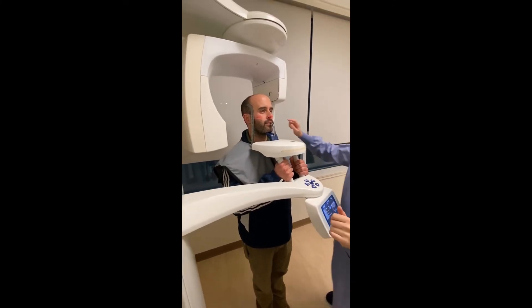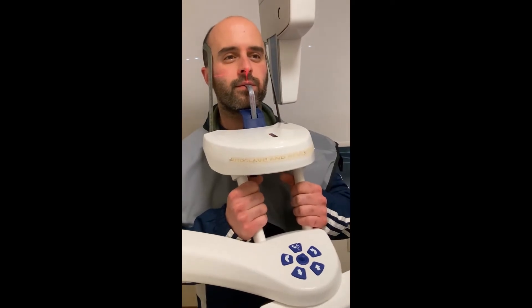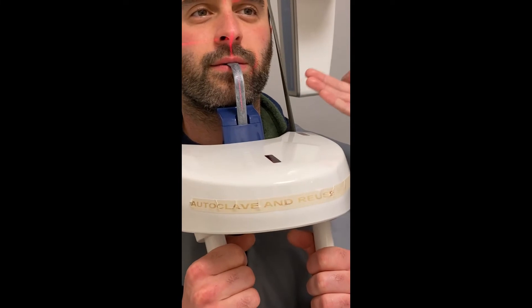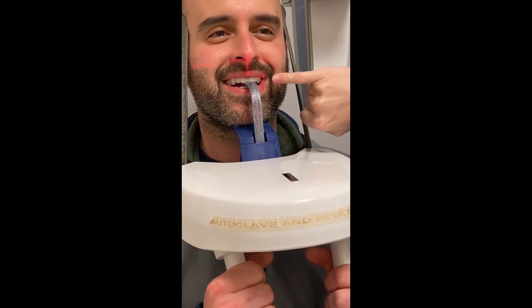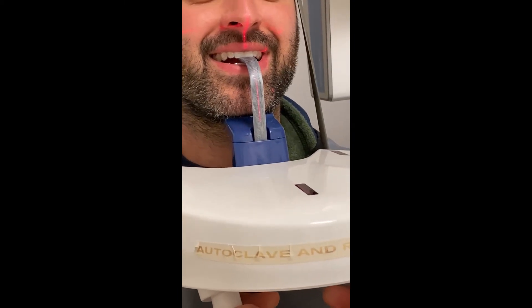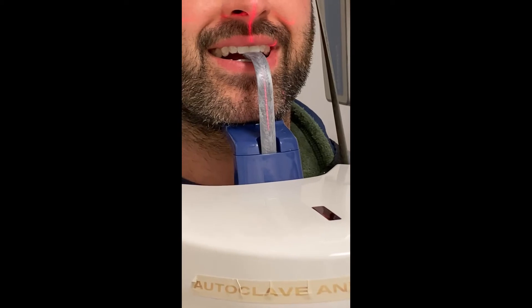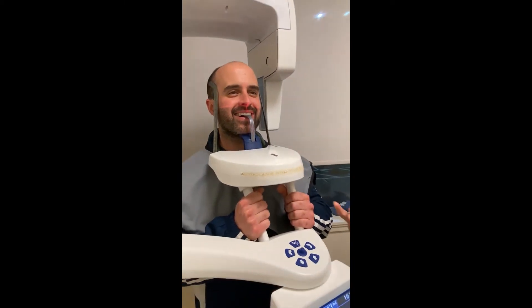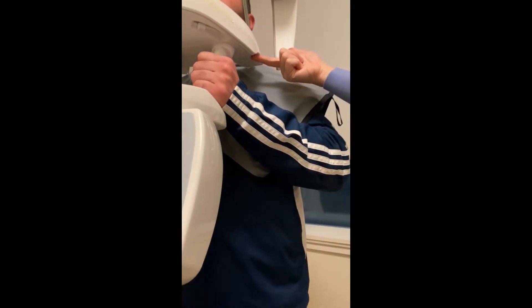The last laser to look at is the canine laser. Ask the patient to smile with their teeth. We're looking for the central beam of this laser to cut directly through the middle of the canine tooth. Adjust the laser slightly back — that adjustment can be found under the machine with the roller.